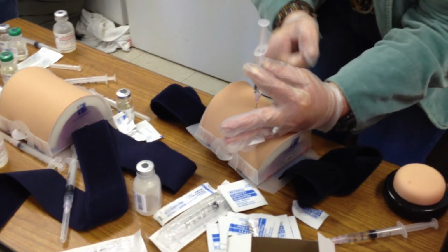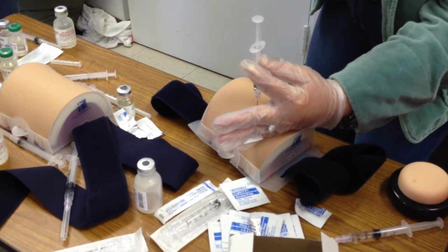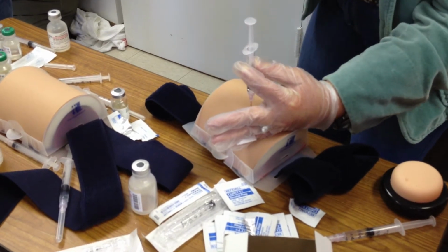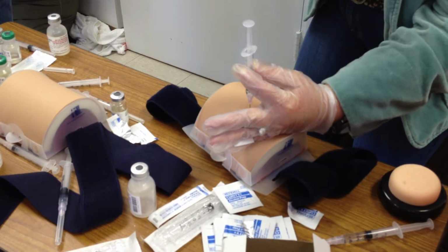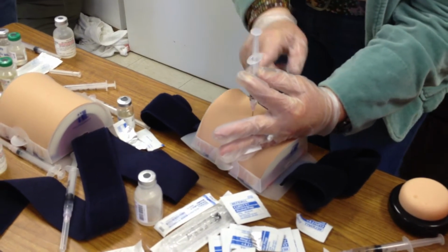Did you see those bubbles bubbling up? That lets me know that's air coming from the tissue itself, so it's not harmful to the patient at all. There's no pink or red swirling up in my medicine to let me know I'm in a capillary or vessel. So you're clear to inject at that point. How far up do you need to pull it to aspirate? Just enough that you can see a bubble.